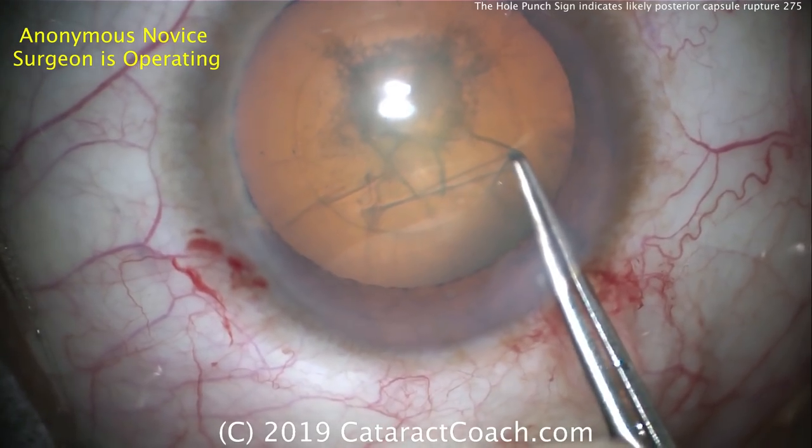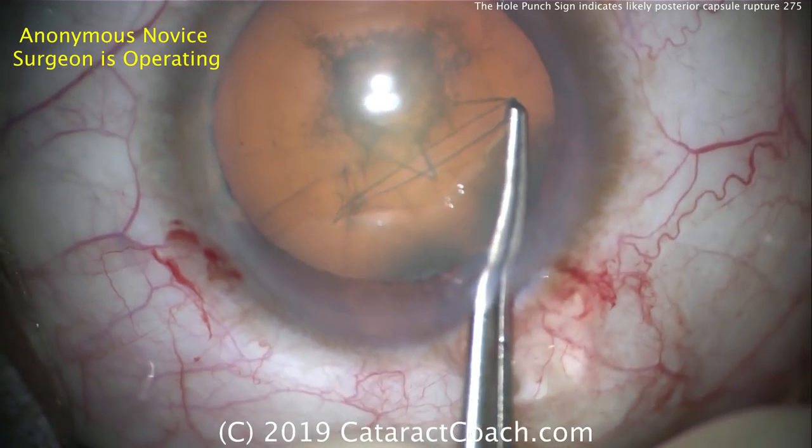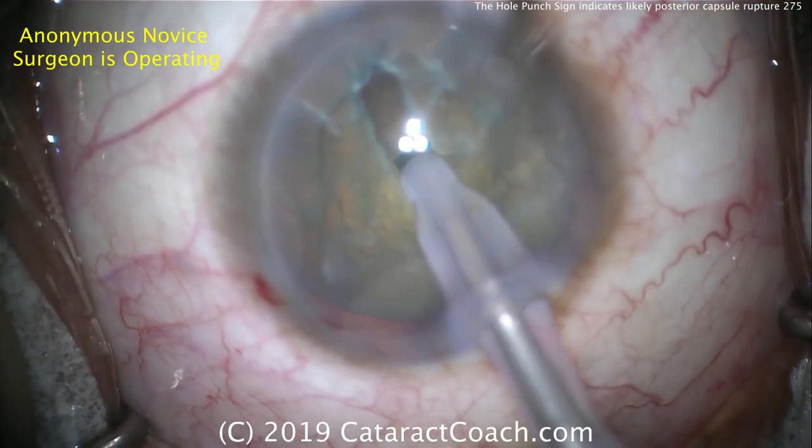Let's watch this case. A normal rhexis is being done that looks very nice — about five millimeters, nice and round, very well centered. This surgery is being done by a novice surgeon with a senior doctor helping.